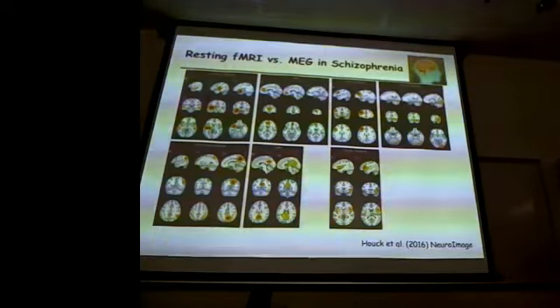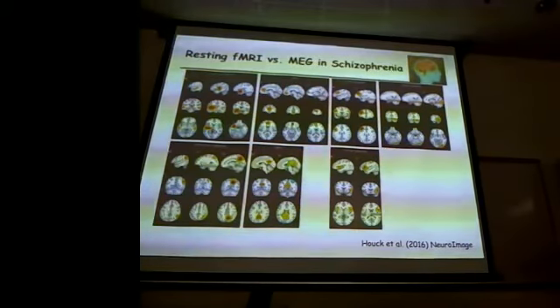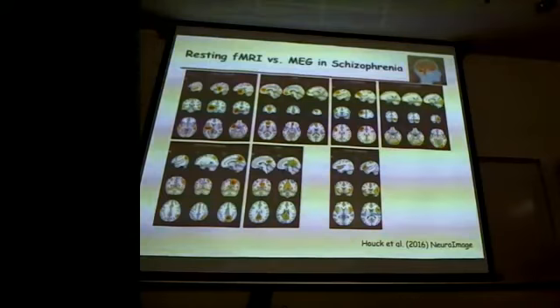This new technology, the optically pumped magnetometers, is relatively cheap to build and doesn't require any liquid helium to maintain. You need high density EEG, with a high number of sensors, in order for it to be comparable with MEG. High density EEG systems are 100K.